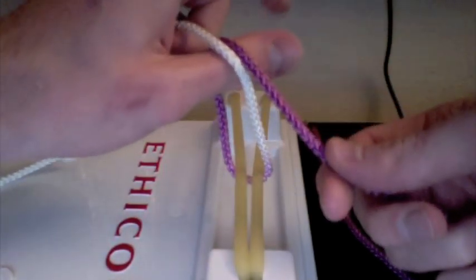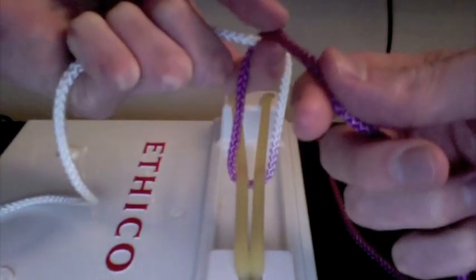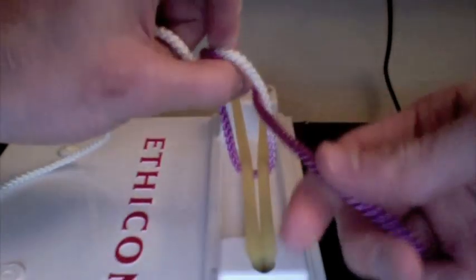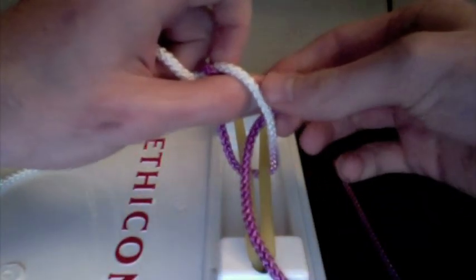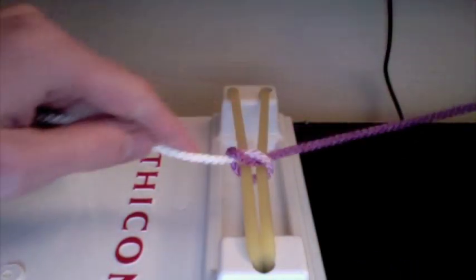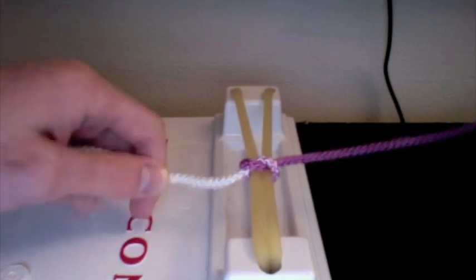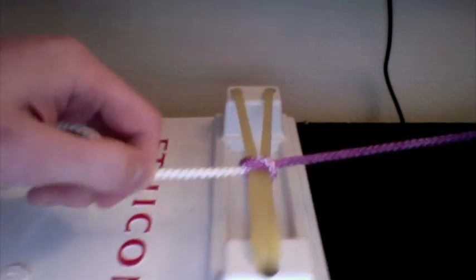I've made my loop and my bird beak, it comes out through the hole, grabs the little worm on the outside, and pulls him right back through where he came from. On the other side, you're just going to grab the purple strand and pull it nice and tight. That's the first move. Notice how it lies nice and flat, as any square knot should start out.